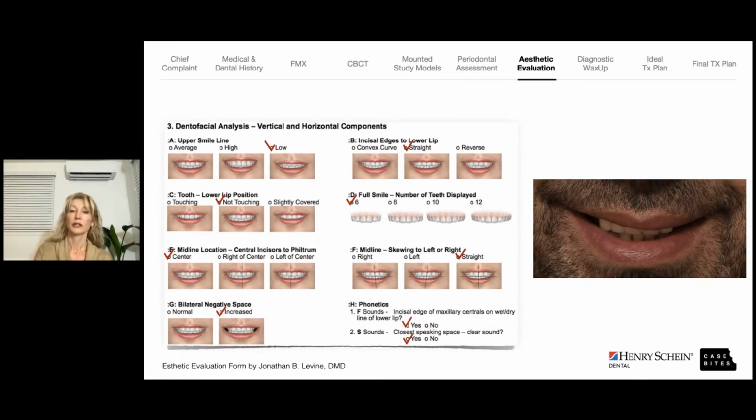F and S sounds pretty good. I do not concentrate too much on the sounds at this point, as whatever the patients usually present with, that is a result of a long-term standing, and the patients can adapt to making the sounds pretty clear. We all know even edentulous patients can say S and F pretty clearly. However, when we are restoring the patient and we're trying to find that new position, at that point is more critical to me.